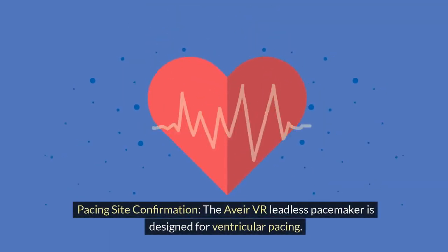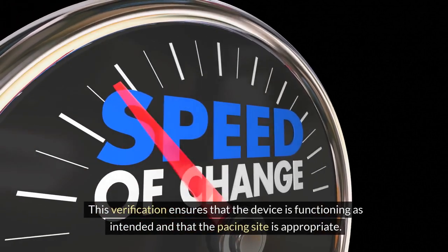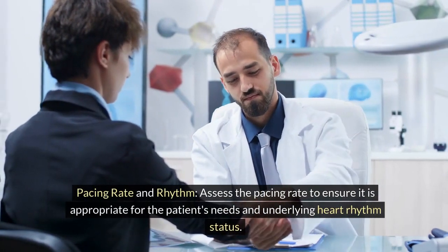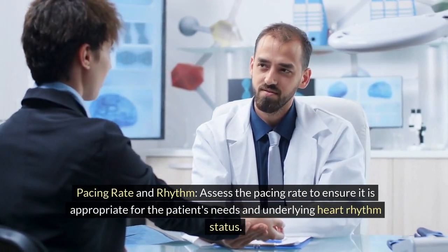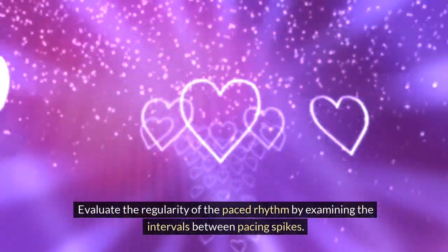Pacing site confirmation. The Aveir VR leadless pacemaker is designed for ventricular pacing. Confirm that the pacing spikes are appearing in the expected lead configuration for ventricular pacing. This verification ensures that the device is functioning as intended and that the pacing site is appropriate. Pacing rate and rhythm. Assess the pacing rate to ensure it is appropriate for the patient's needs and underlying heart rhythm status. Evaluate the regularity of the paced rhythm by examining the intervals between pacing spikes.